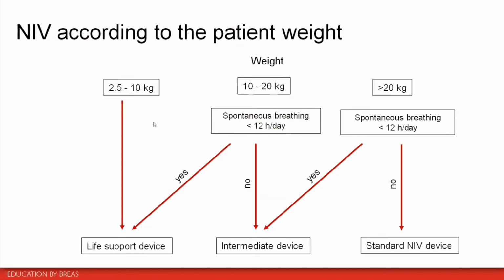Once again, this is our practice. We'll go with a life support device for children that are usually under about 10 kilograms, just to be sure that we'll have correct detection of the flow and so correct trigger of the device, and no problem of asynchrony between the patient and the ventilator.